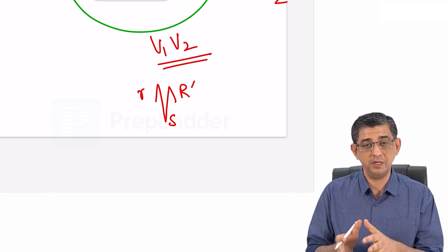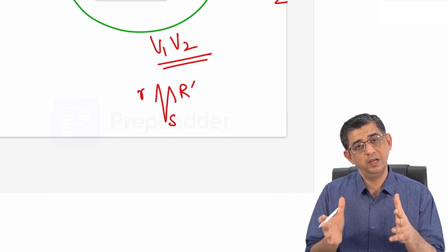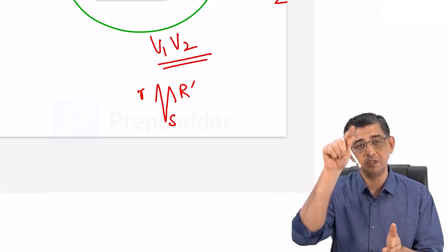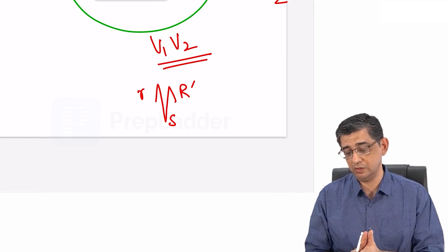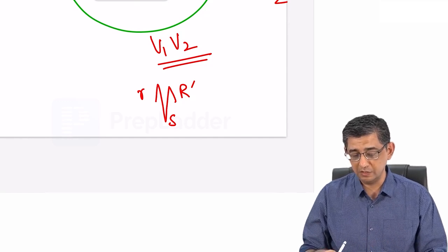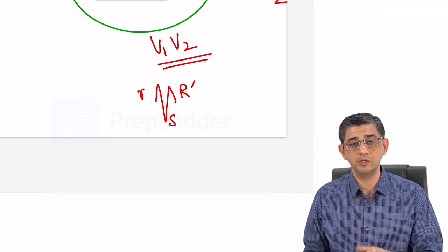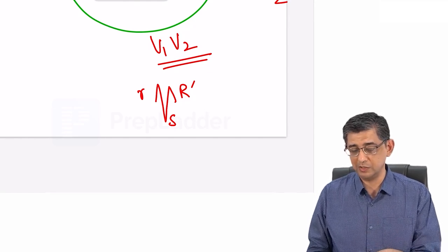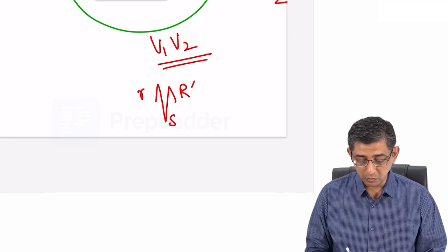What I mean by different is that ideally the R of left and right ventricular activation is merged together. In you and me, the left ventricle and right ventricle are both depolarized at the same time, so the current is merged together and we have a single R wave. But in this case, the two different R waves represent a sequential activation of the ventricles. Anything that goes up is R, anything that comes down is S. And the different sizes, why one is written small and one relatively bigger, is because the right ventricle has less muscle as compared to the left. So per se there can be a disparity in the height of the R versus R, as I will show you in the ECG also.